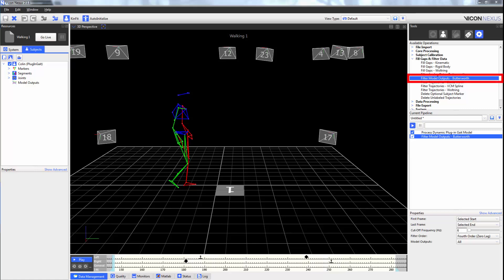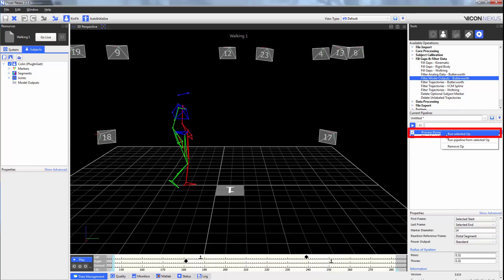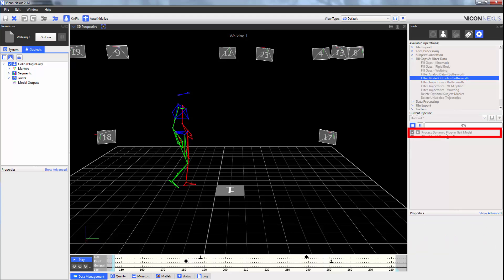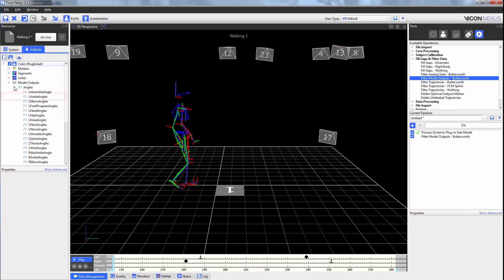The filter model outputs Butterworth filter is a low-pass filter that is run on your data after the model outputs have been mathematically calculated. In this case here, I'm going to run the dynamic plug-in-gait model. We can see here that we now have some model outputs. In this case, I'm going to choose my left ankle angle and plot it.